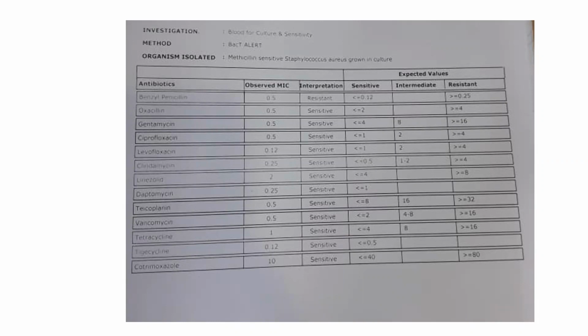Yes. So see, when you do an automated machine, so basically they inoculate, they use a standard inoculum of the culture media, the bacterial colony, and the card that they use, it has a fixed concentration of a particular drug. Okay. So instead of doing it manually, it is doing it on its own. So it is the same principle. Like in discs, every disc has a certain concentration of a drug, and you are using a standard inoculum of a bacteria on that plate. So it is the same thing which you are doing.